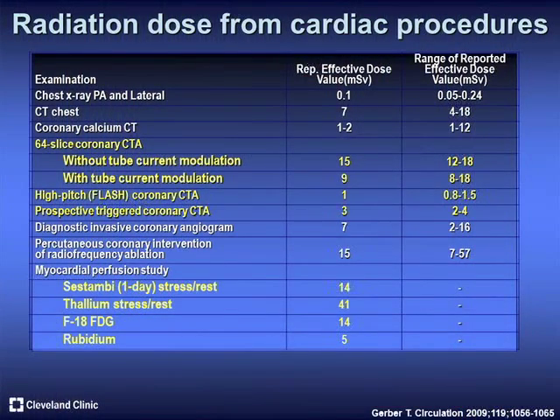Now, radiation dose, you cannot talk about an isolated test. Bottom line is CT started off with 15 to 20 millisieverts. We can do a CT angio now in as low as 1 millisievert in selected individuals. Compare this to nuclear, where we still give a sizable dose of radiation for a given patient. And this has not changed for a long time.